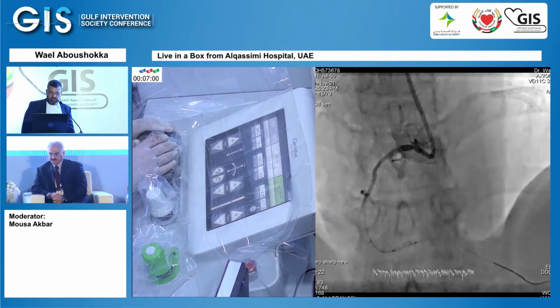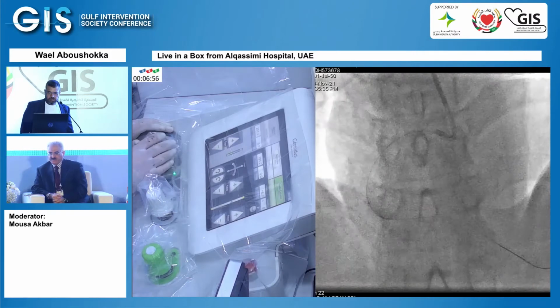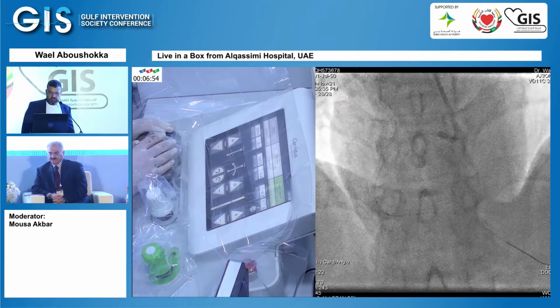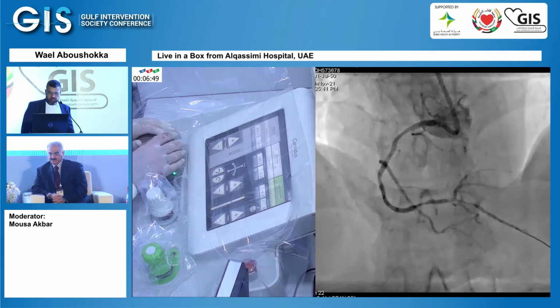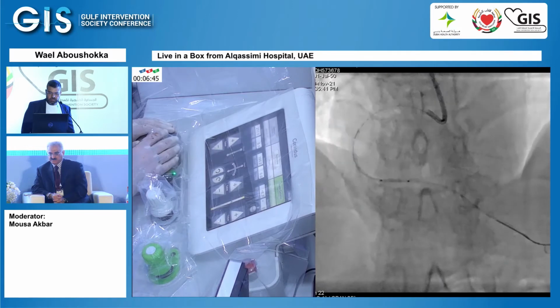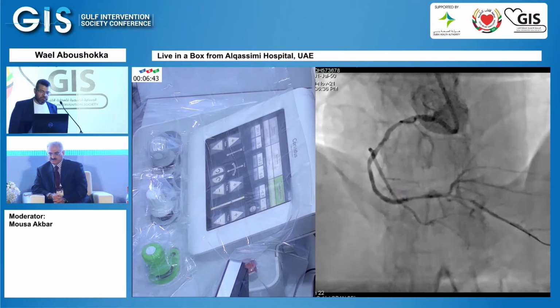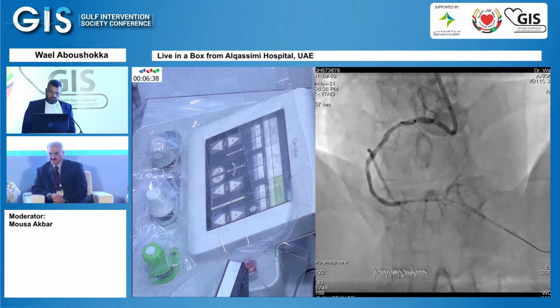Okay, we can go a little bit back. Inject, please. Okay. So now we got a flow.